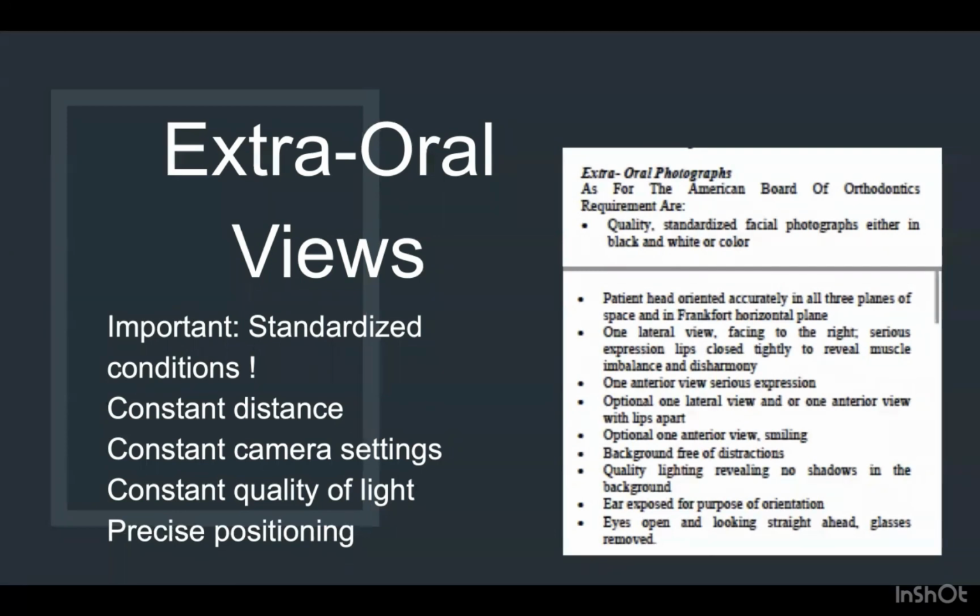So the best thing is that you enter your clinic and ask your assistant to stand, the background should be white. So stand in different places and try to take a picture and see at what position there is no shadow. You can utilize the daylight. In four walls, there must be some place where you can get a picture without any shadow, right?